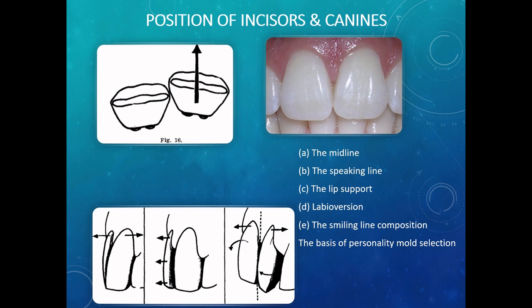And their importance actually lies in their primary forward positioning in the mouth, and they are the first teeth to be seen during the smile. Their shape is controlled by the physical personality of the patient, and their positioning determines the strength and action of the dentogenic composition. The relationship of the central incisors to each other is also important. One central incisor is always placed broadly ahead or behind the other, as you can see in this picture. And from there we give different degrees of rotation, labial inclination, and axial divergence, which produce effects of additional strength, activity, and vigor to the entire dental composition.